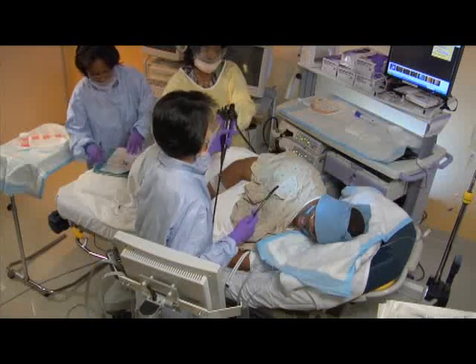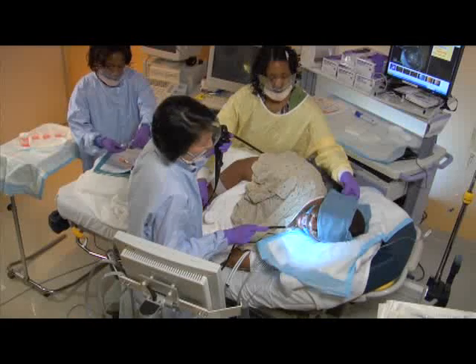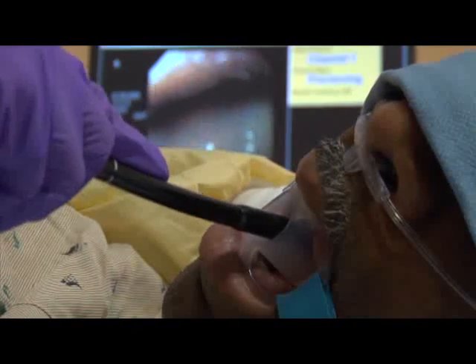Then, your doctor will gently maneuver the endoscope into position. As the endoscope is slowly and carefully inserted, air is introduced through it to help your doctor better see the images. Your physician will use the endoscope to look closely for any problems that may require evaluation, diagnosis, or treatment. In some cases, it may be necessary to take a sample of tissue called a biopsy for later examination under a microscope. This, too, is a painless procedure. In other cases, this endoscope can be used to treat a problem such as active bleeding from an ulcer.